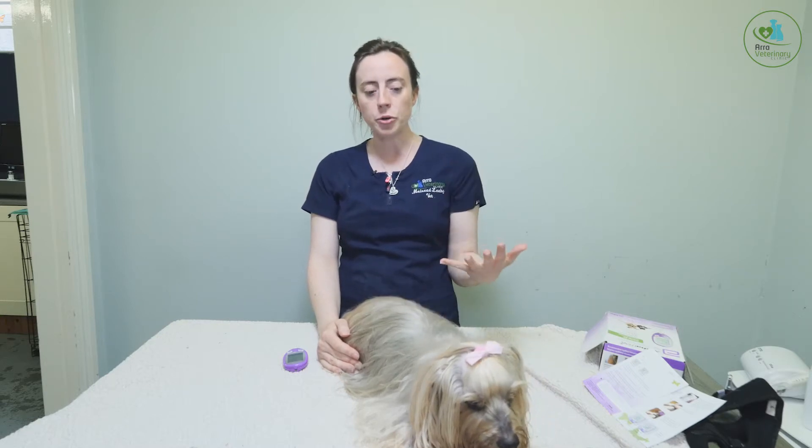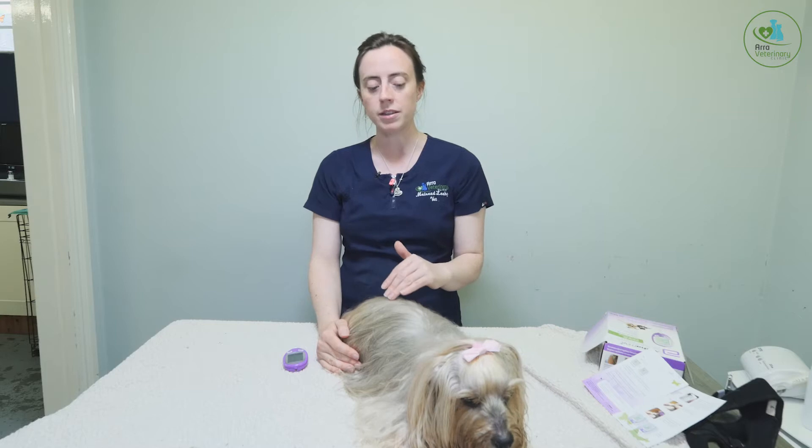Today we have Ruby in for a blood glucose curve. That is a series of blood tests throughout the day so we can see how well her glucose is controlled throughout the day, how well the insulin is working, and whether we need to increase or decrease the dose.